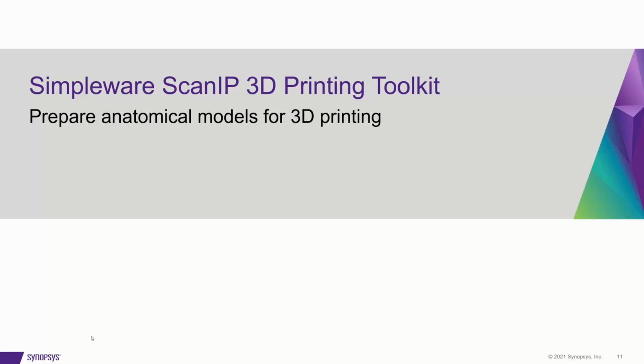Great, thanks, Grim. First, just quickly to introduce myself, my name's Ross Cotton. I'm the Applications Engineering Manager for the Simpleware products at Synopsys. And it'd be my pleasure today to talk you through the new ScanIP 3D printing toolkit, as Grim just mentioned.